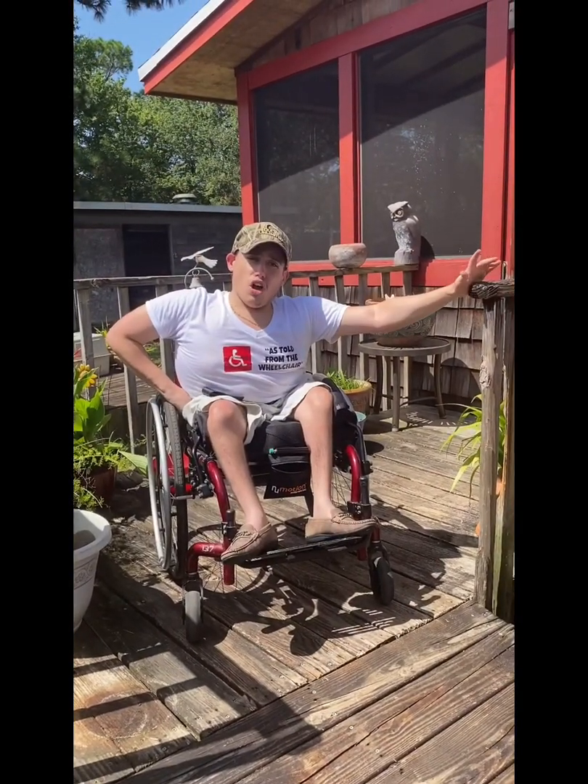So now I'm going to teach you how to go down this ramp very effectively. What you're going to want to do — I like to put my hands back here, and then sitting up, keep an eye on your surroundings. And this is how we're going to do it. Right like this. As you can see, that was as smooth as silk.